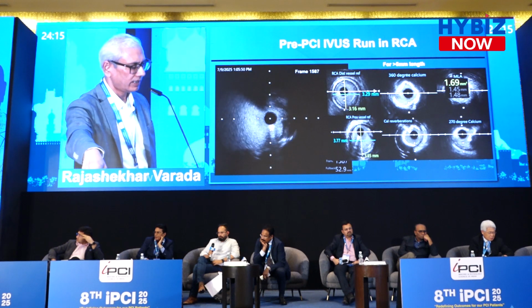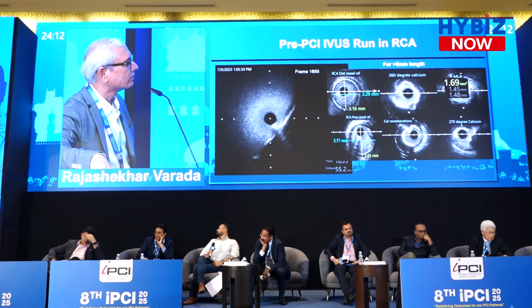Very nice inputs there from the panel. This is the pre-PCI run, and the RCA, and we chose to do the RCA first. I'll let the entire run play, and then I can invite some comments from the panel.